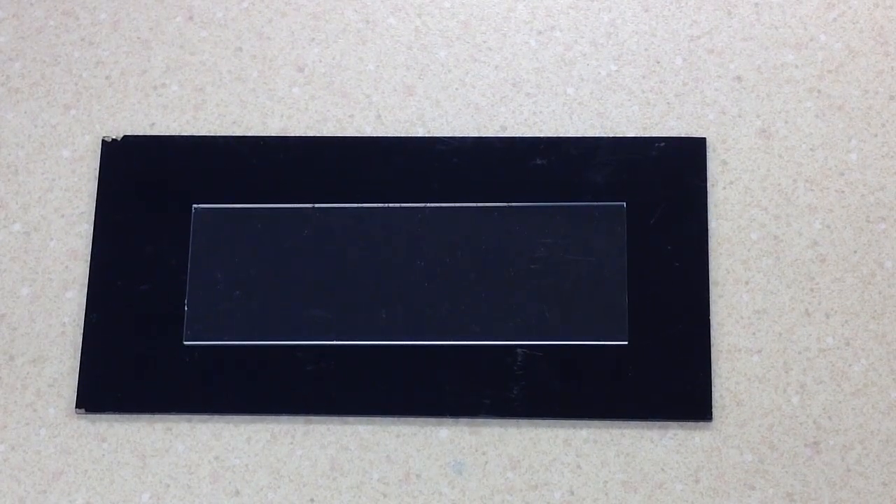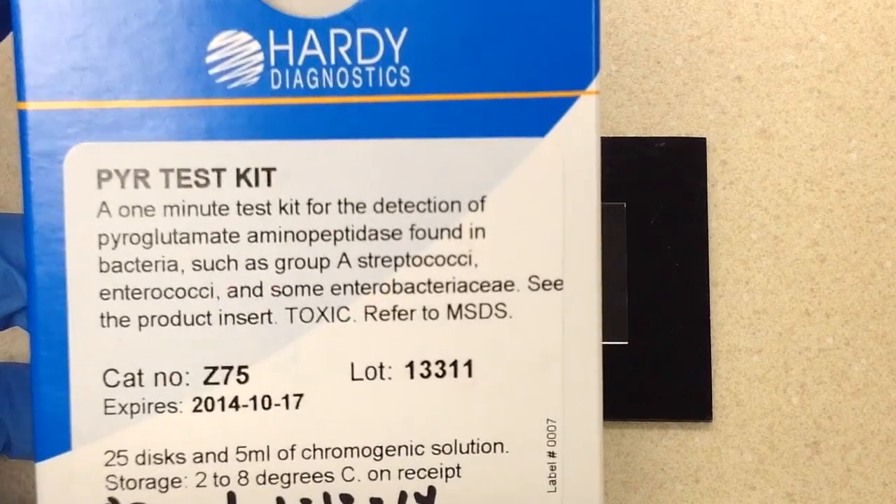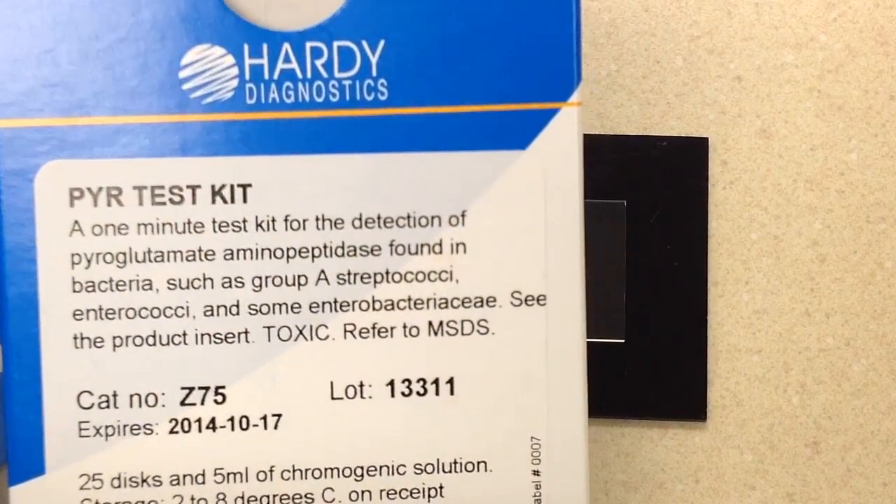In this video, we are going to look at the PYR test. The PYR test is used mainly for the identification of Streptococcus pyogenes, otherwise known as Group A Strep, and also for Enterococcus species. The kit we're going to be using is by Hardy Diagnostics, and this is a rapid test kit, and we should have our results in just about 3 minutes.